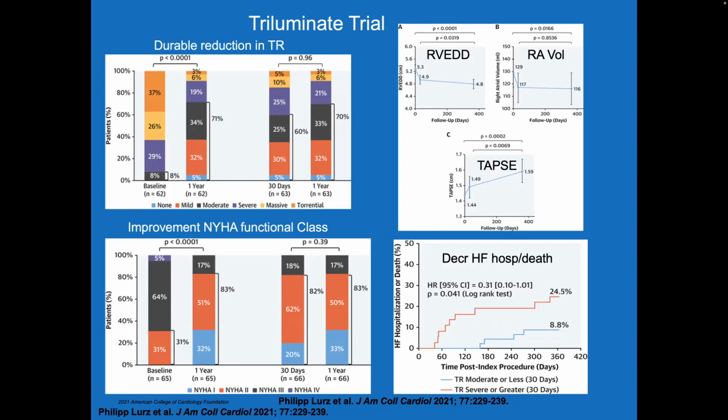What we're trying to accomplish is a clinical benefit to these patients, and the trial data thus far showed an improvement in New York Heart Association functional class, as well as data of decreased hospitalization from heart failure and death. So it's been positive, and I think that as soon as these devices are FDA approved, there's going to be a lot of referrals for this procedure, and that means a lot more imaging for us and trying to figure out patients that would benefit from the therapy.